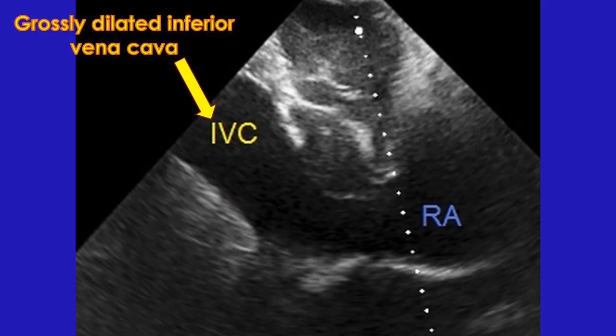Parts of the superior and inferior vena cavae can also be imaged by echocardiography. Inferior vena caval size is often used at the bedside to assess hydration status for guiding fluid therapy. A normal inferior vena cava collapses in inspiration with at least 50% decrease in dimensions. If the inferior vena cava is dilated and does not collapse in inspiration, it is called plethora of the inferior vena cava. Inferior vena caval plethora indicates high right atrial pressure.